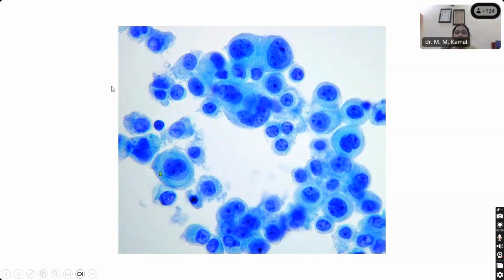These cells have windows in between them. Clefts or windows, yes. With some cells showing a fraying of cytoplasm. Yes. Centrally to eccentrically placed nucleus with prominent nucleoli. Yes. And the dual tone cytoplasm can be appreciated in a few cells.